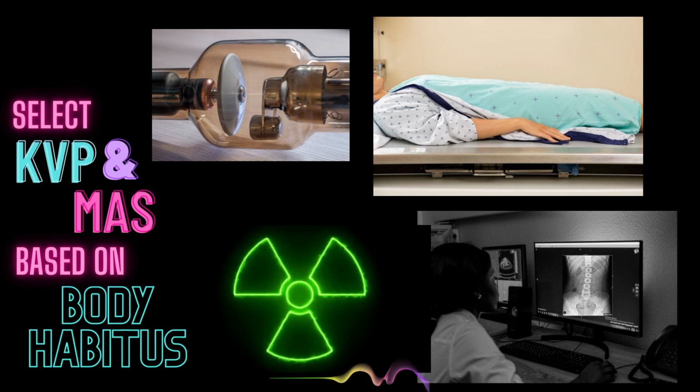Now at the console, we will want to verify that we have the correct patient pulled up and then select our KVP and mAs settings based on our patient's body habitus. Alternatively, we can use the AEC function if we are confident in our centering. For a supine abdomen, the AEC cells selected would be all 3 cells.